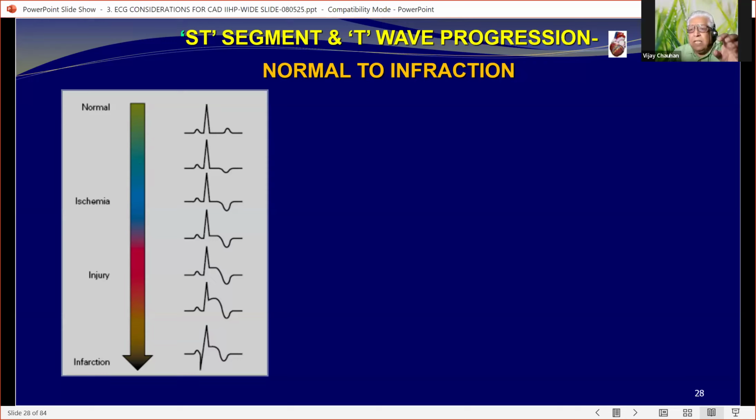If we have coronary artery disease, you may not have the symptoms, but ischemia is there, then you will see T wave inversion. The repolarization is not taking place. Your muscle is not recovering from the stress it has been undergoing during systole. It is working, but when it should get relaxation and its oxygen supply, it is not reaching it in the diastolic phase, and it is not recovering. The heart muscle is not recovering.